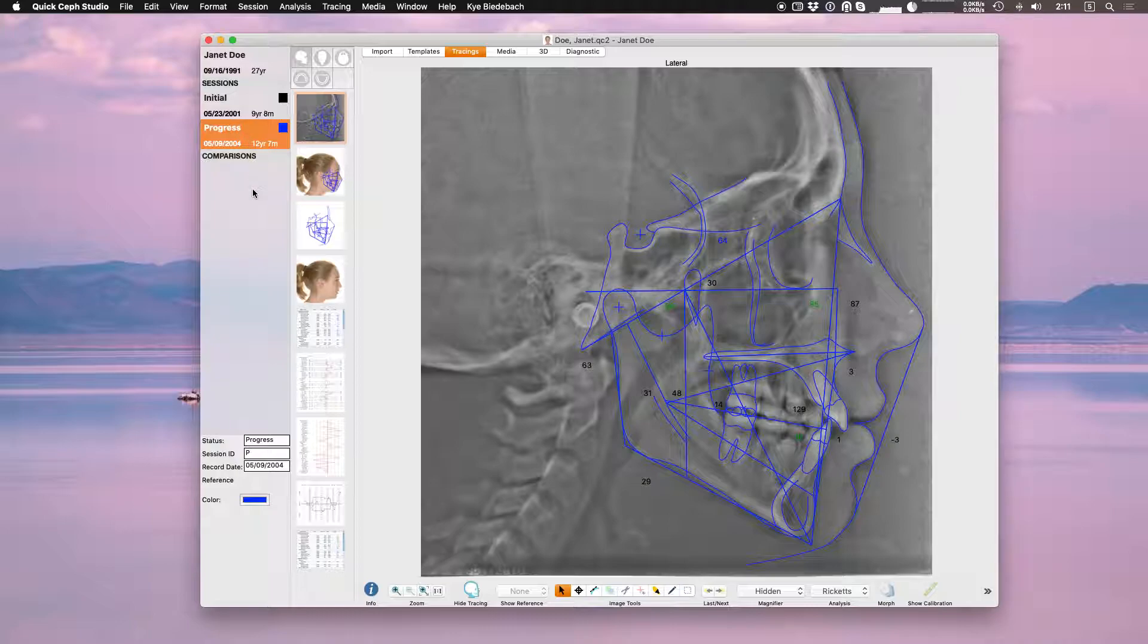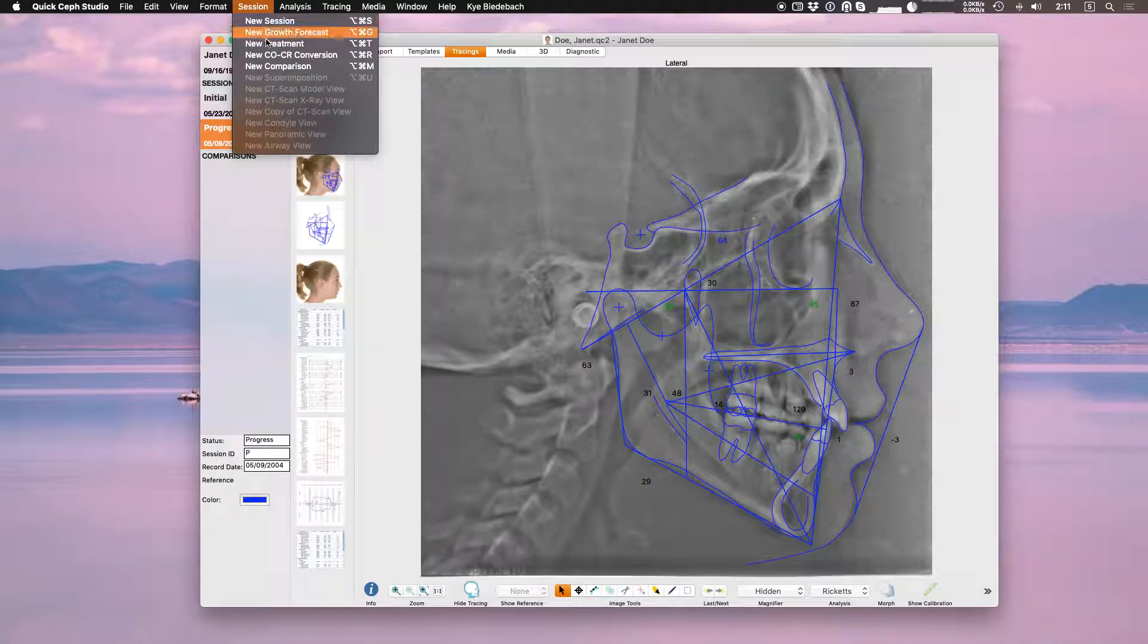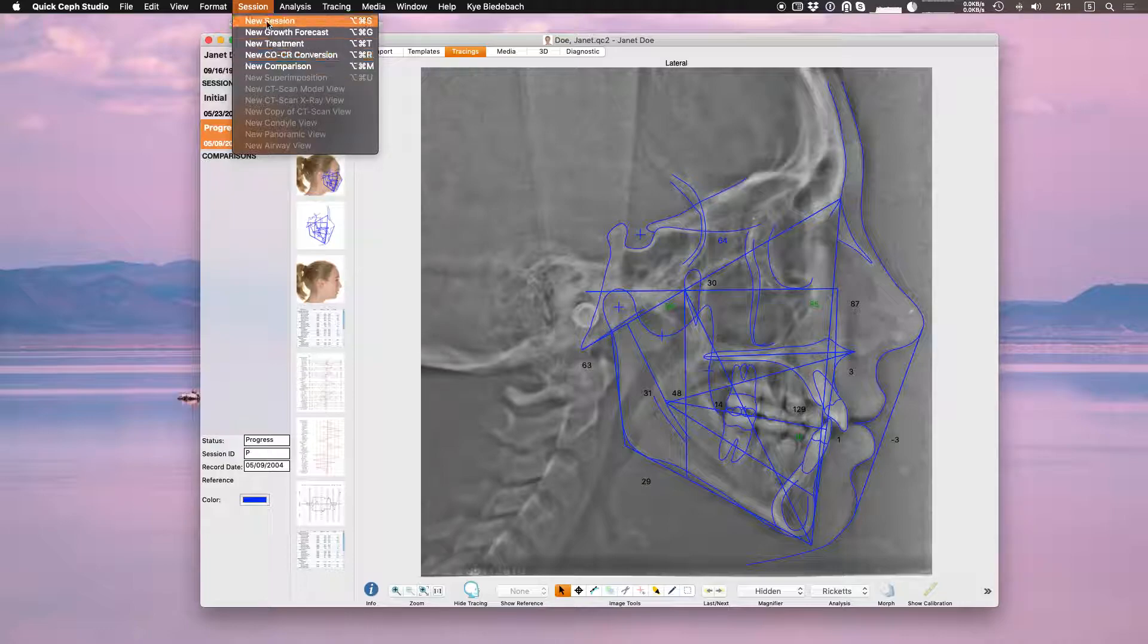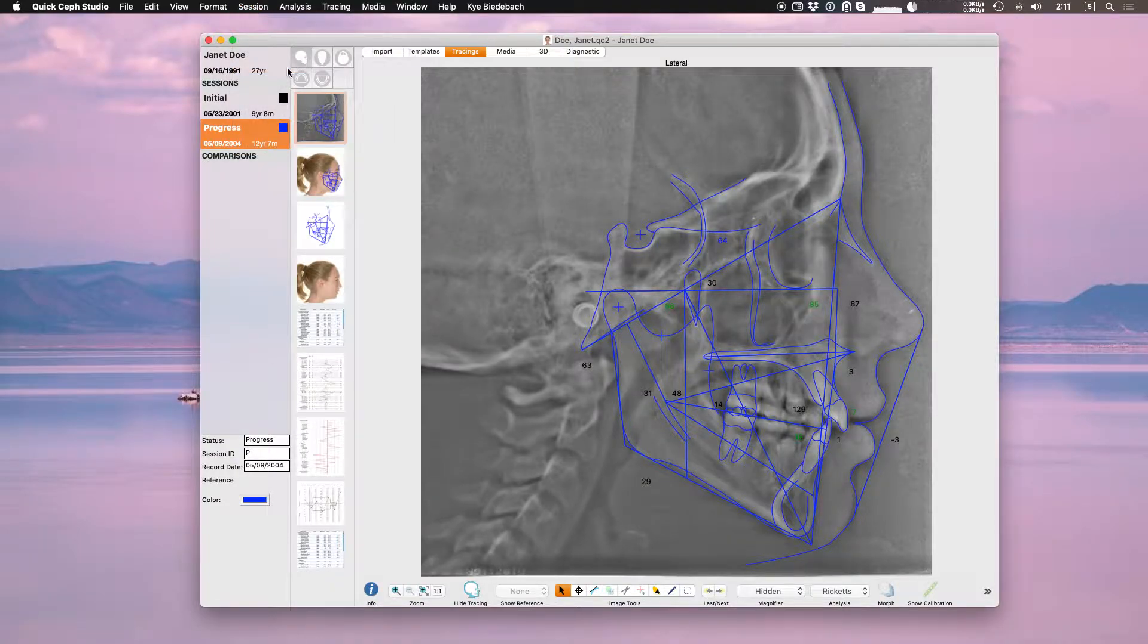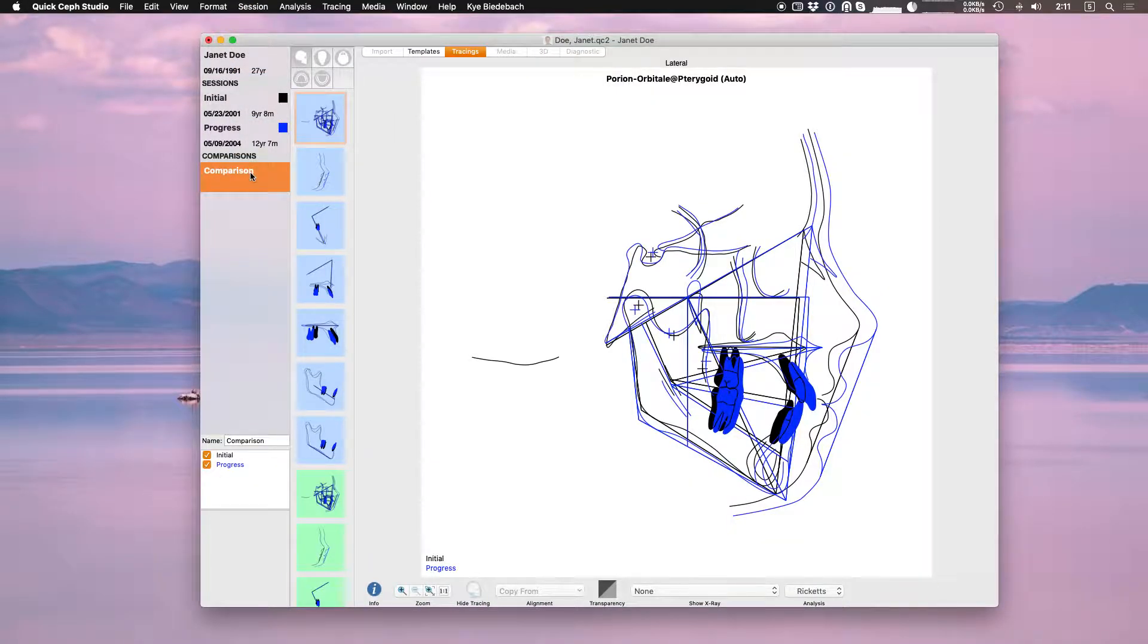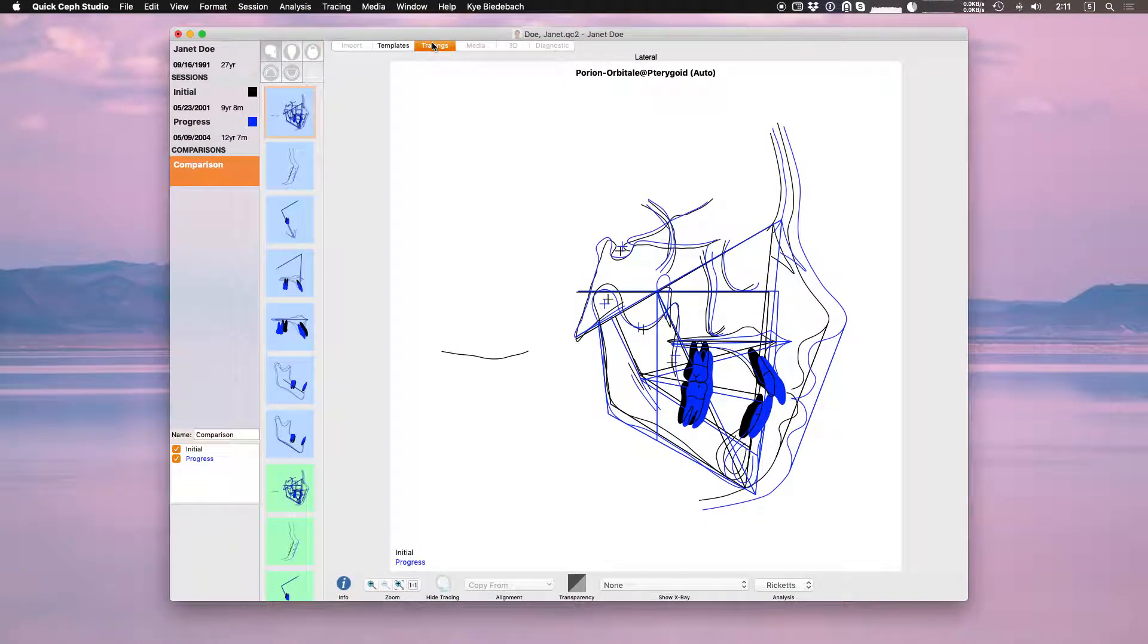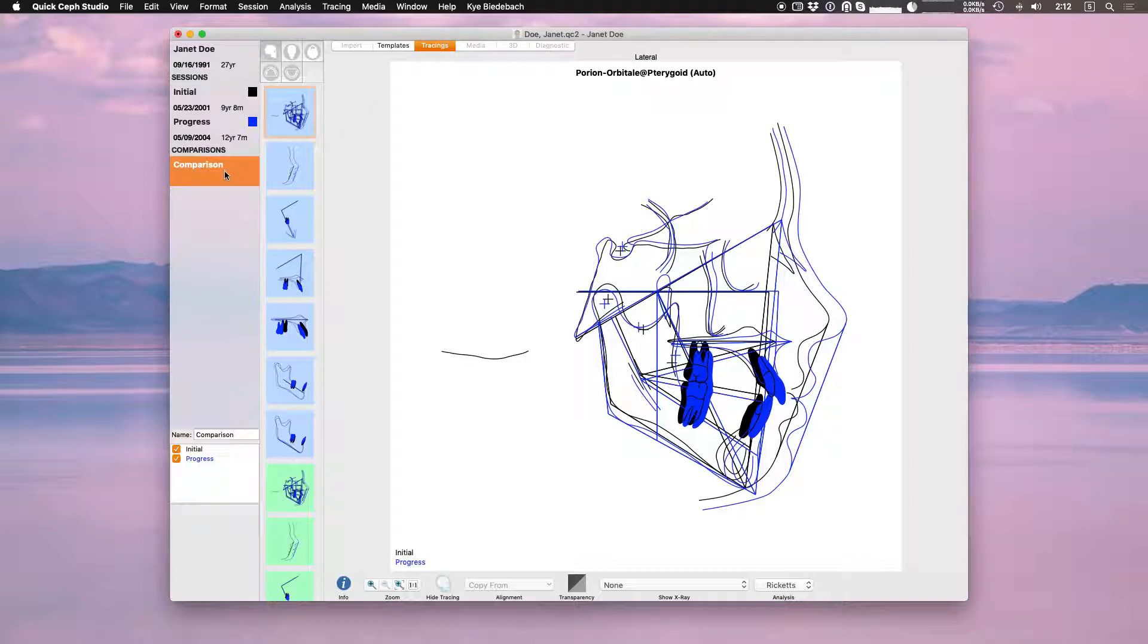Before we can see the superimpositions we need to create a comparison session. Come up to the session menu, click on new comparison, and now you have a comparison session. The superimpositions are shown in the tracings section while you have the comparison session selected.